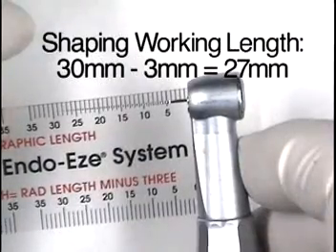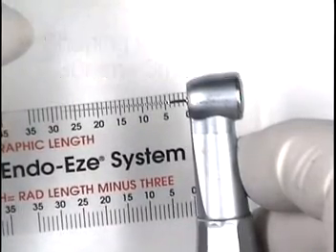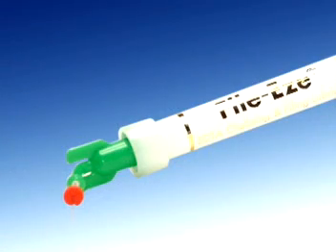In this case, this tooth is 30 millimeters long. We're going to be working in the middle portion of the canal with the shaping files, which is the area three millimeters short of the apex, to the canal orifice.